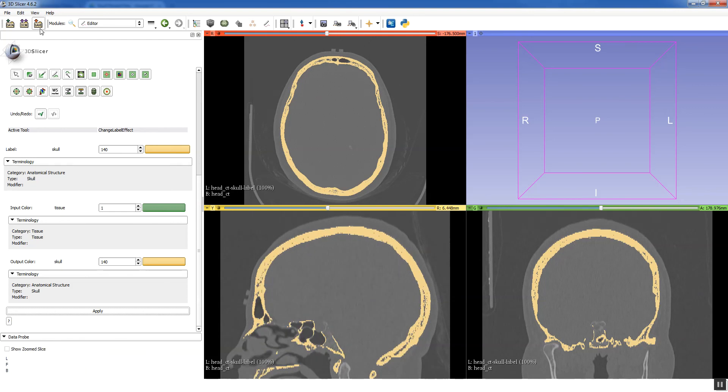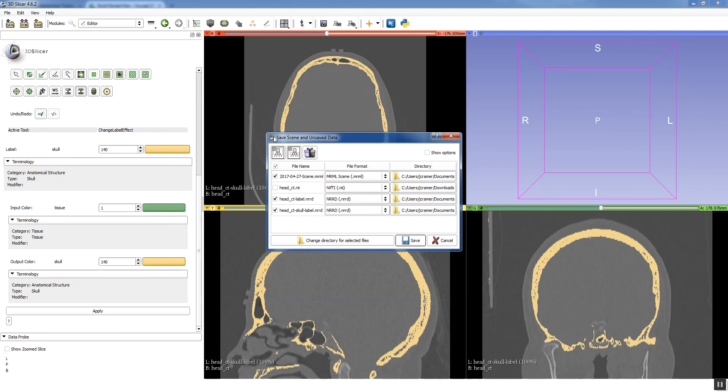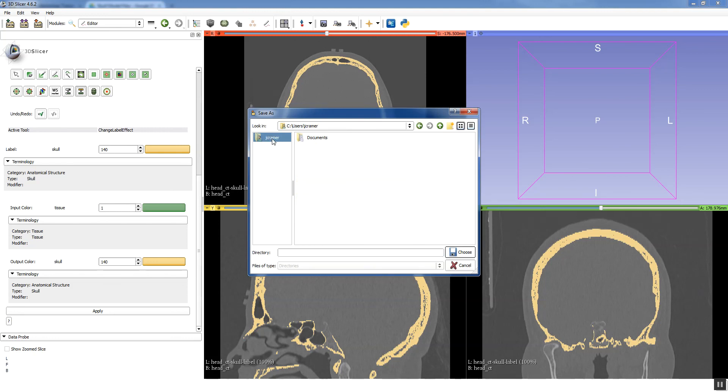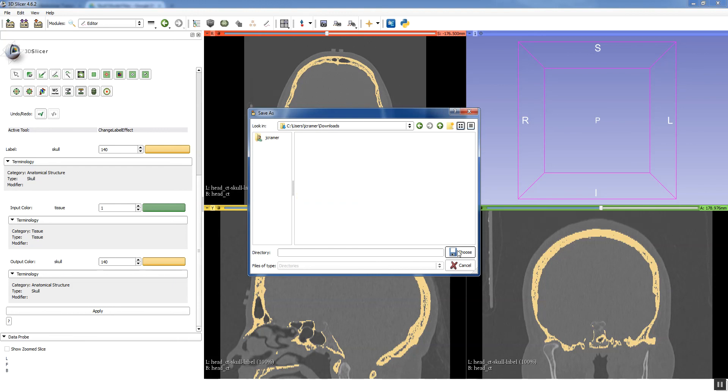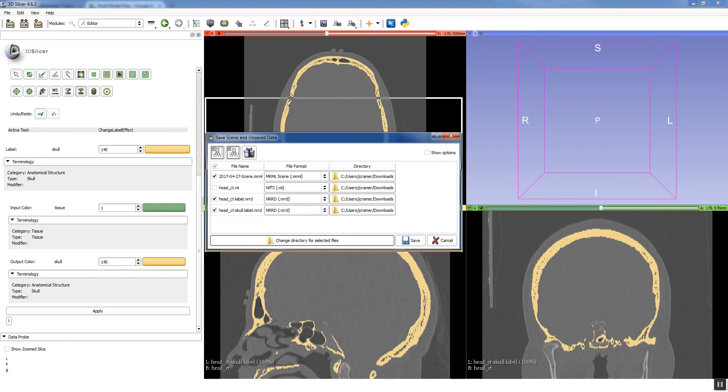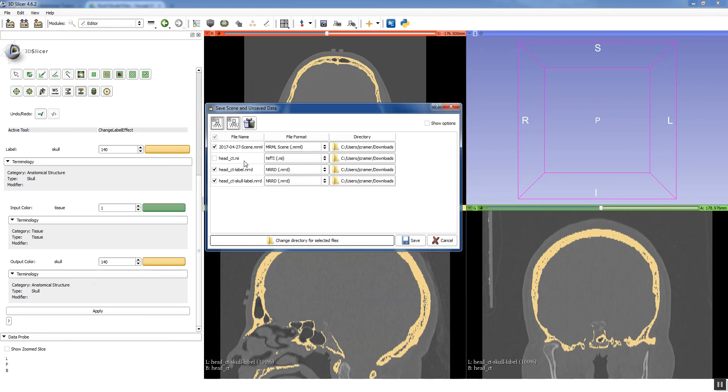So now we want to save our progress. And any time you're working with 3D files, it's just a good idea to save your progress. Slicer is a pretty stable program. But the last thing you want to do is spend 30 minutes segmenting something and crash without anything saved. So let's just go ahead and work in the downloads directory. You change directory for all files. I'm going to go to my downloads directory. Choose that. And this is the slicer save interface. Pretty much everything you create in slicer is a separate file. So our skull label is a separate file. The CT label is a separate file. The initial volume. And then finally there's an MRML file. And that's basically, that's a slicer file. So you can double click on that. And it will open up where you were in slicer. That works in Windows. It doesn't seem to in Mac.